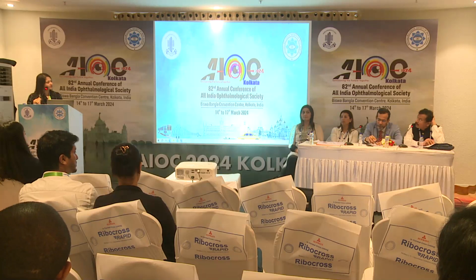It's a bold move and a good study, but you could have included the complications and what the difficulties are in doing it, and also it's high myopes. If the bottle height is high, there is something called iris retropulsion. Yes, so the chamber becomes very deep. If you could have included those things, it would have been a very nice study. But anyway, congratulations. Thank you, sir. Thank you.